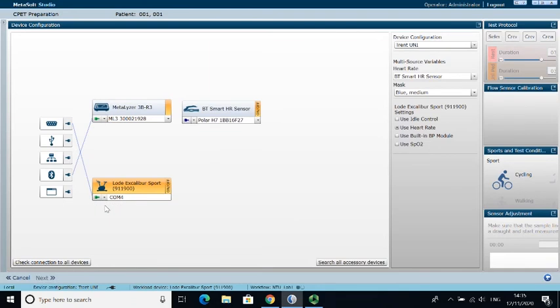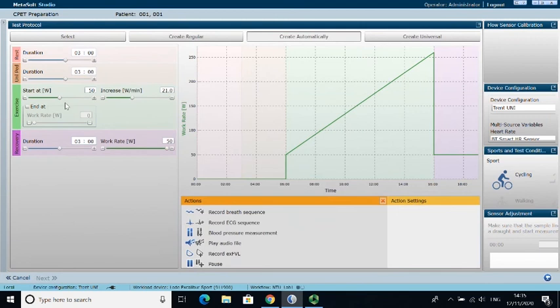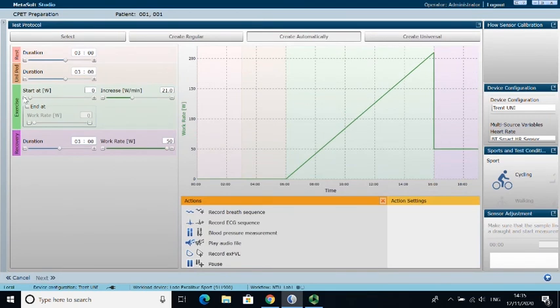Alright, so finally I've managed to figure out what was going on there, and then I can move now into the sort of next phase really. Right, so what I've opened up here is, now we've told the machine that the bike is going to run the test, we need to set the particular protocol that we're interested in.